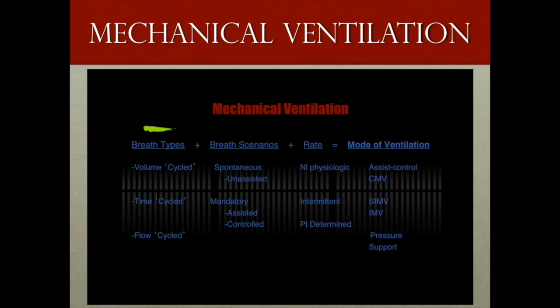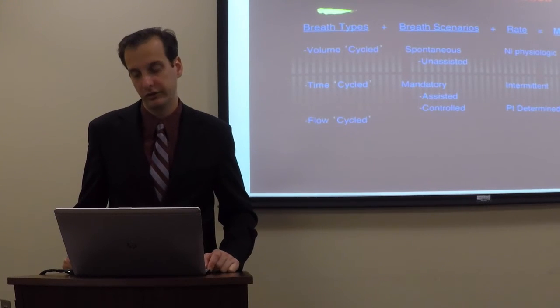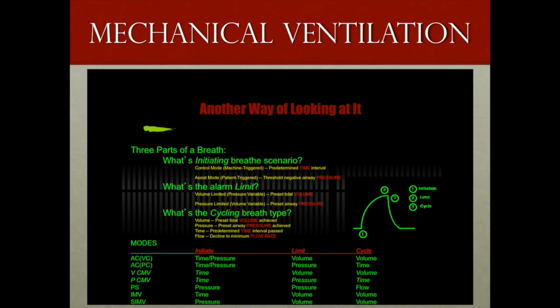And from these modes, you will have a strong enough basis to develop an understanding of more complex, more advanced, and newer modes of ventilation. There is another way of looking at it. You can think of your breaths delivered by mechanical ventilation as having three characteristics to them. What is initiating the breath, in which case, what is the breath scenario?